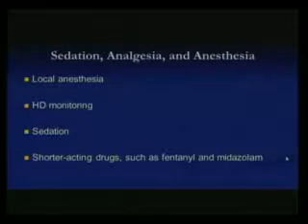So talking about going forward, when we bring the patient to the vascular suite, we have to make sure they're a good candidate for sedation, and we have to decide what kind of analgesia or anesthesia we're going to use. So the options with us is just do it under local anesthesia, use 1% lidocaine. You have to make sure you have good hemodynamic monitoring in the room, blood pressure, oxygenation. And then coming to sedation, usually use Versed and fentanyl.